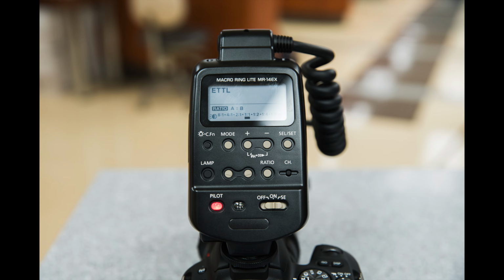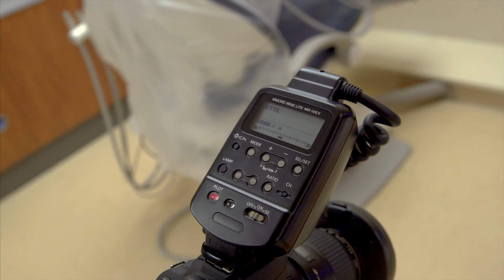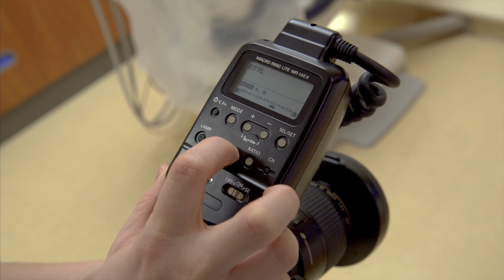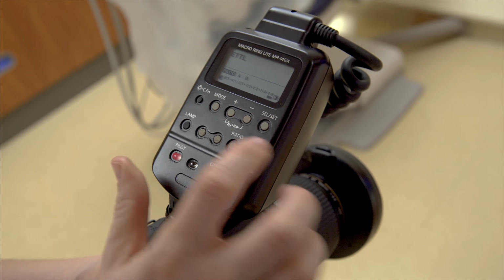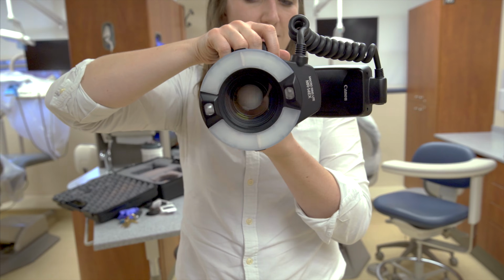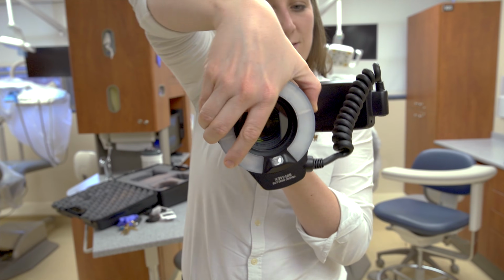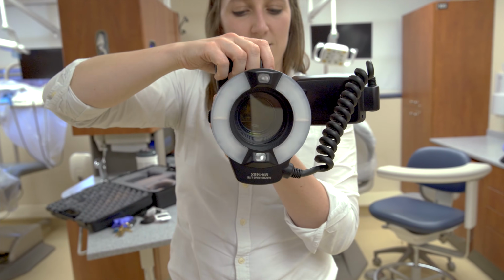For the side profile, you need to turn off one side of your flash. You do this by changing your flash ratio to one side, usually using a toggle switch, and turning your flash so that the hot flash, or the active flash, is on the side of the nose. To achieve this, I usually turn off my left flash, then move my flash counterclockwise 90 degrees, and have the patient so that her nose is on your left.